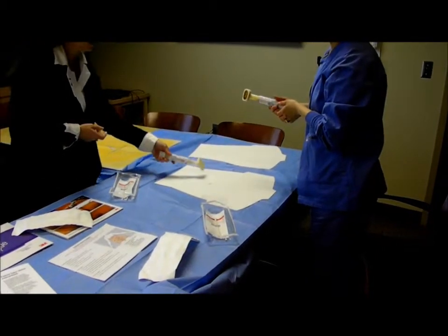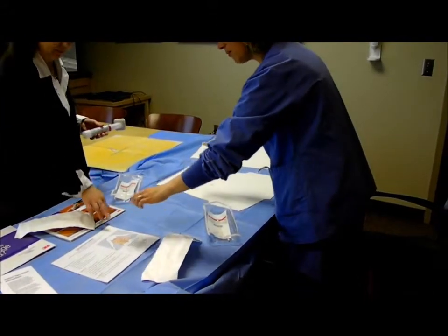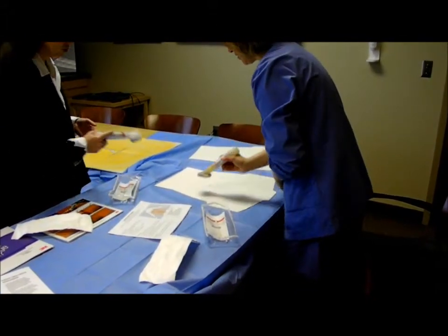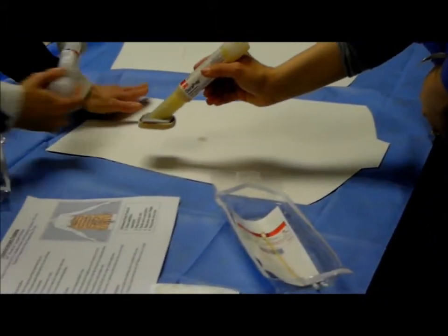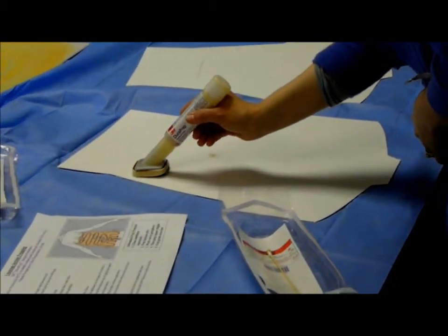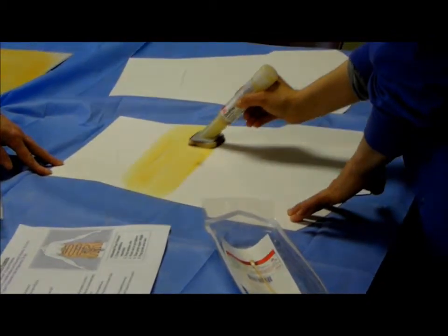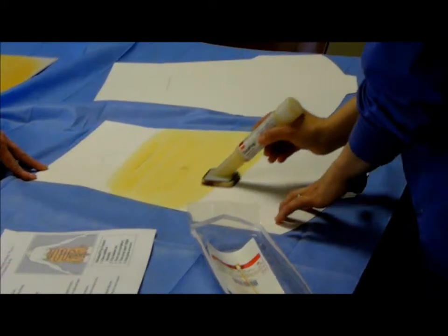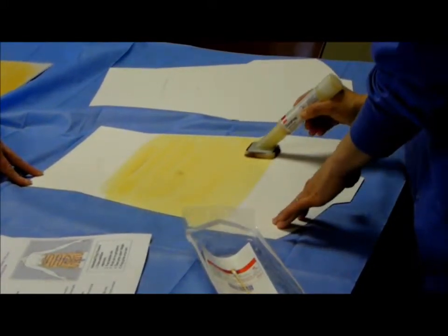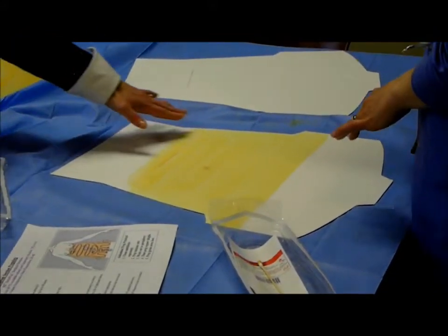Perfect. And then you're going to start at your incision site, and in this instance your incision site is here, using a back and forth motion. So I'm going to go down first. You're going to do the belly incision site first, and then you're going to go around, you're going to do this area last. So start here. Correct. And then right up to underneath the breasts, right? Right, perfect. Then you're going to do the upper thighs, so you could start like here and do that.